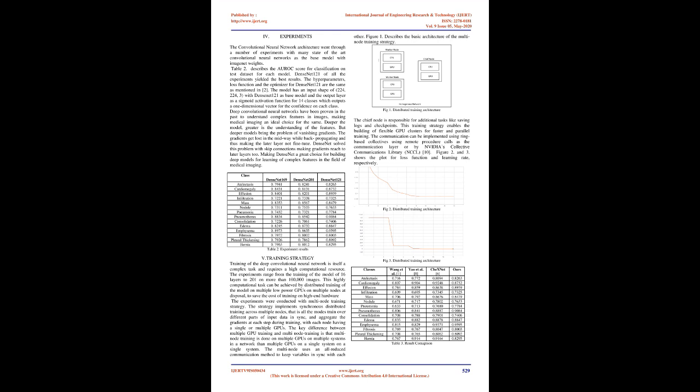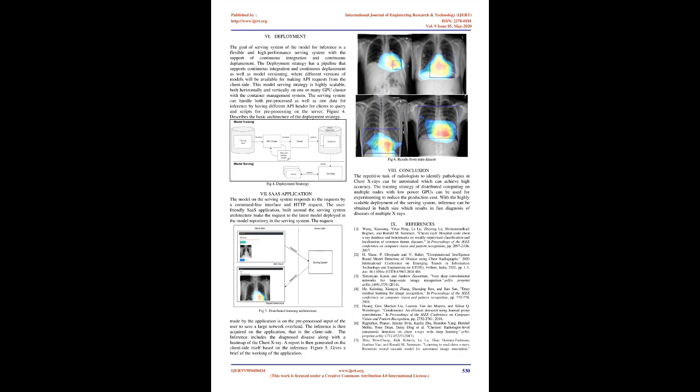Deep convolutional neural networks have been proven in the past to understand complex features in images, making medical imaging an ideal choice for the same. The deeper the model, the greater the understanding of the features. But deeper models bring the problem of vanishing gradients.